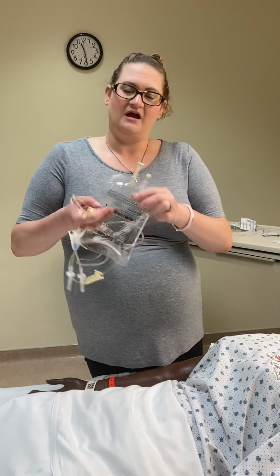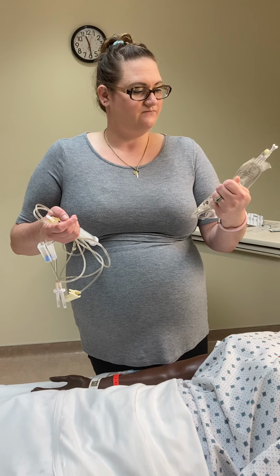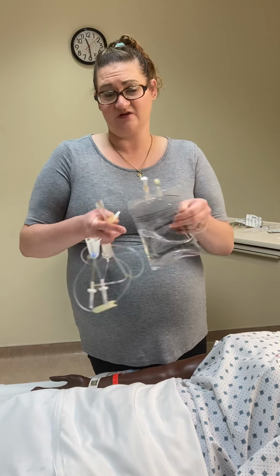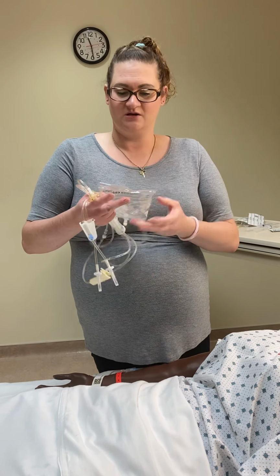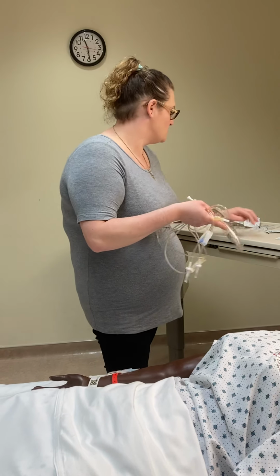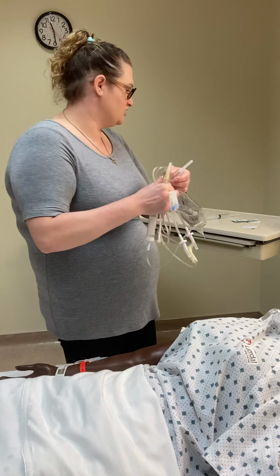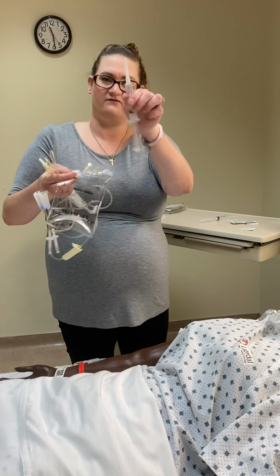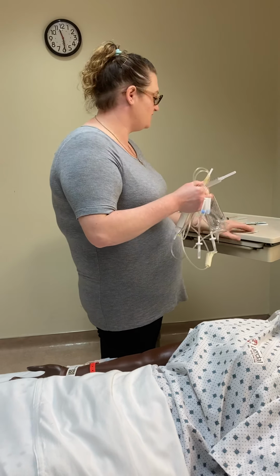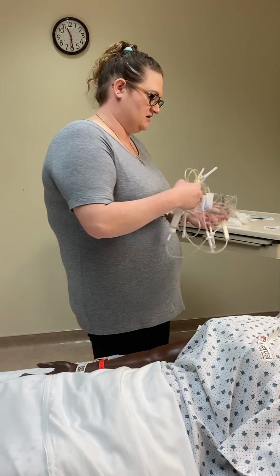There may or may not have the saline order in the MAR. In the past, when I've worked on the floors, it was not specifically in the order, since it's kind of more so for a flush, but you may have it depending on where you're working. I will also need a flush, and since it's a simple connector, I have a blunt tip cannula on the end of it. You'll need your alcohol swabs, and you'll need gloves.